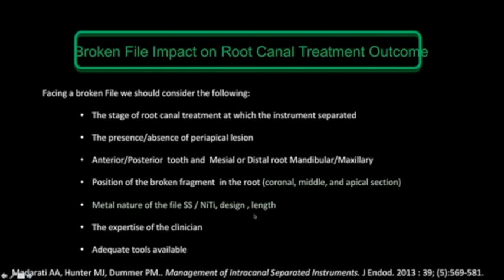So the second point is the position of the tooth, anterior or posterior. Each individual case has its own unique characteristic that will dictate the approach taken to manage the case. So if we have an anterior or posterior tooth or a mesial or distal root, what's the impact of that? The influence of the anatomical factors can be explained, in fact, in terms of visualization of the instrument and the access to get to the instrument.